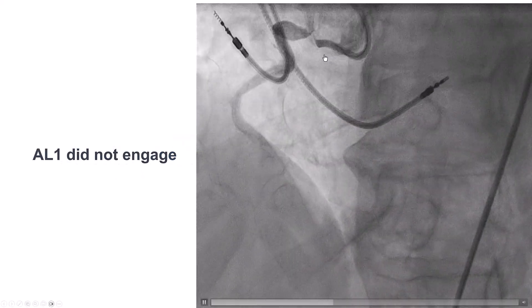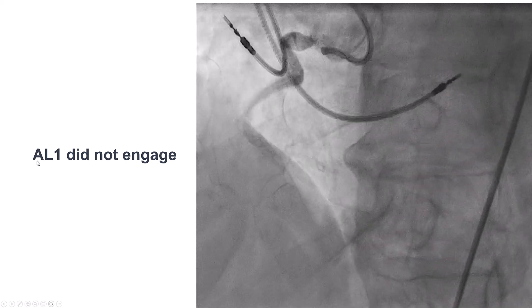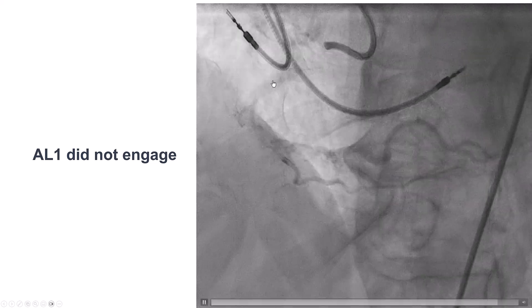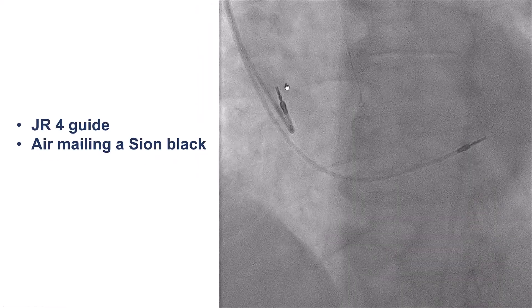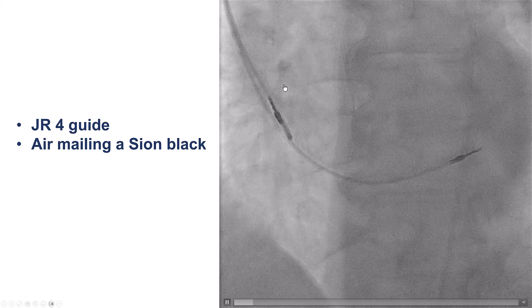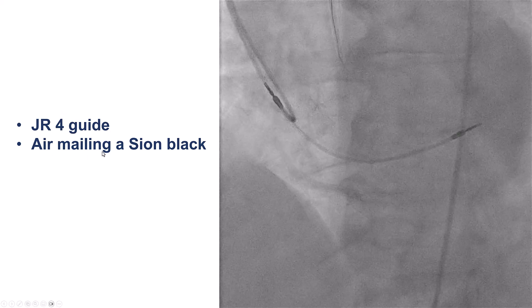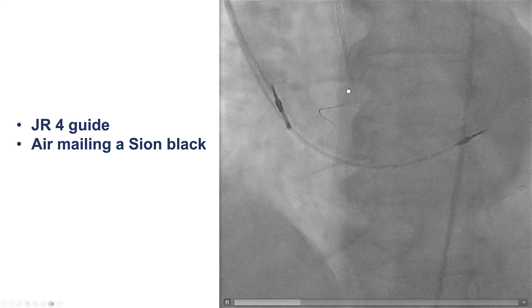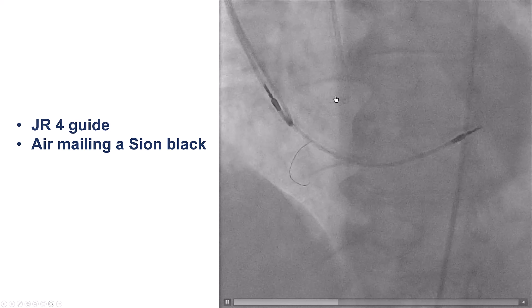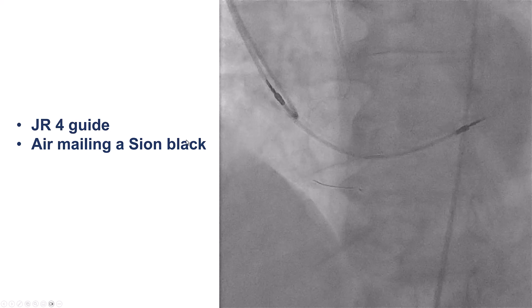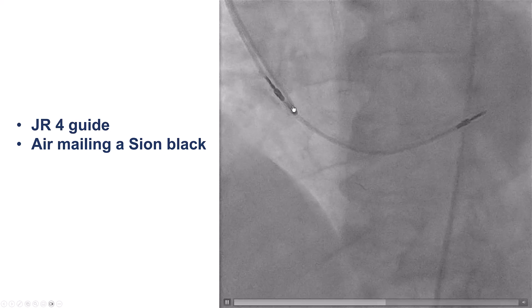Still, engagement of the coronary artery was extremely difficult. We tried with an AL1 and JR4 but could not engage. Eventually, we used a technique called the airmail technique. We got a JR4 catheter and tried to align it as much as we could with the ostium, and then we took a polymer-jacketed wire, a Sion Black, and tried to advance it blindly.